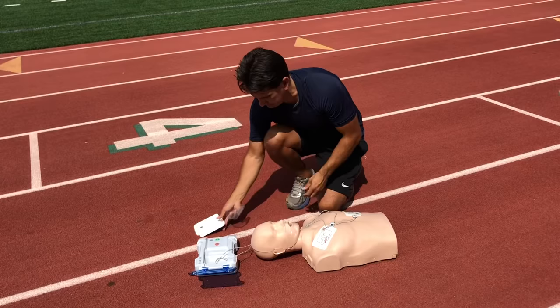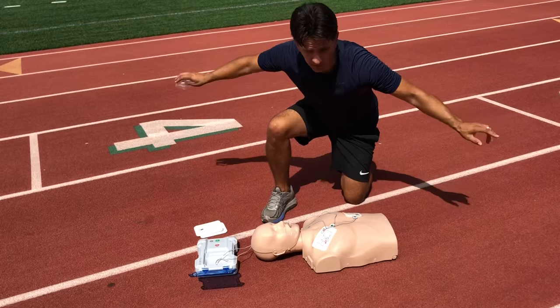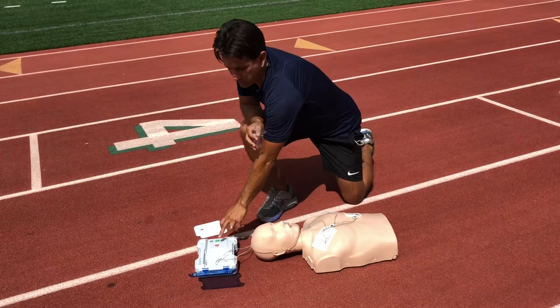The AED announces: shock advised — do not touch the patient. At this point, you will need to clear the victim, meaning you must ensure no one is touching the victim. There is an orange button you'll press to deliver the shock.